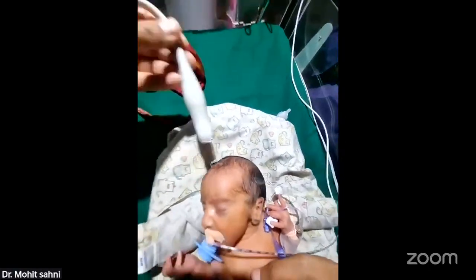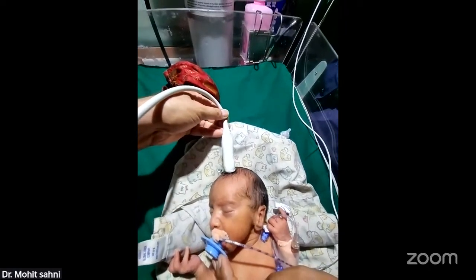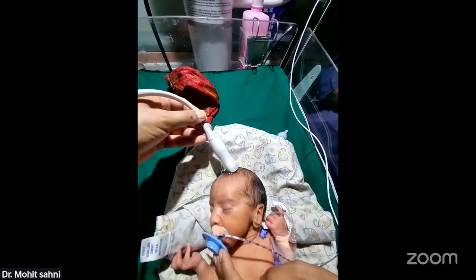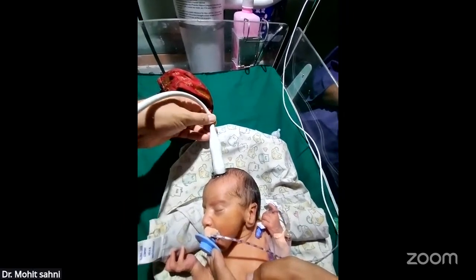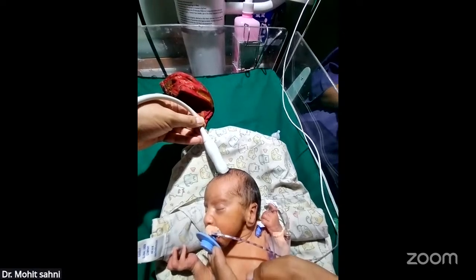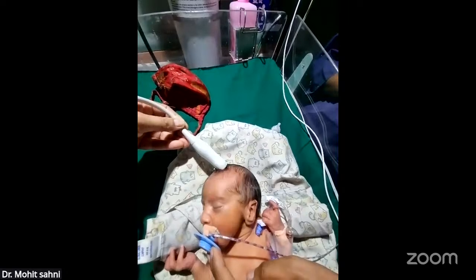So we go from most anterior to posterior. We will see various sections: C1, C2, C3, C4, C5, C6.